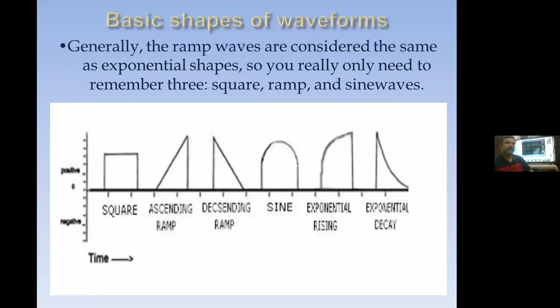And the basic shapes of the waveforms. You should remember the basic shapes of the waveform. The ramp waves are considered the same as the exponential shapes, and then the square and the ramp, as well as the ascending ramp and descending ramp. Sine waves you can also find, and exponential rise and exponential decay.